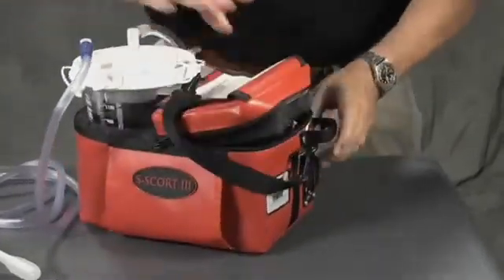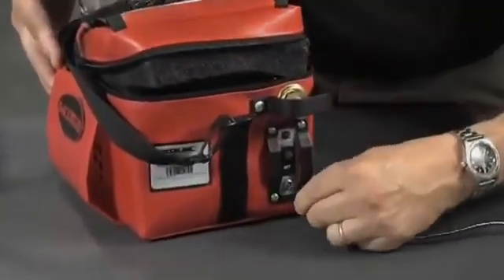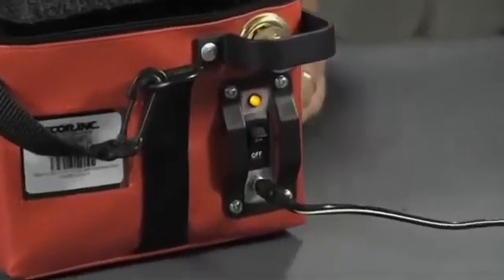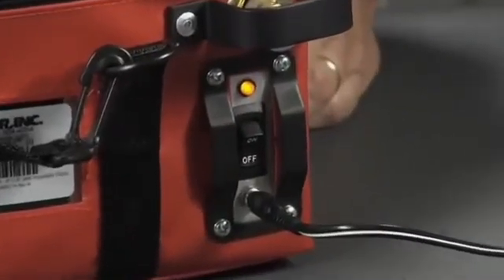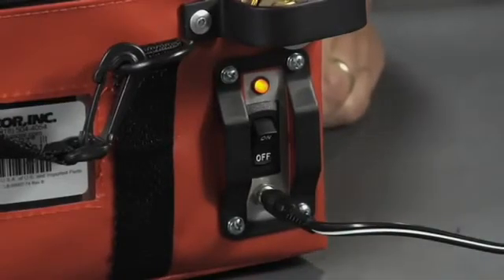As with almost all critical battery-powered devices, keep the Escort 3 plugged into DC power or the SCORE AC-DC charger at all times when it is not in use. This will help to ensure a good charge when you need to use the device, and it contributes to battery life.